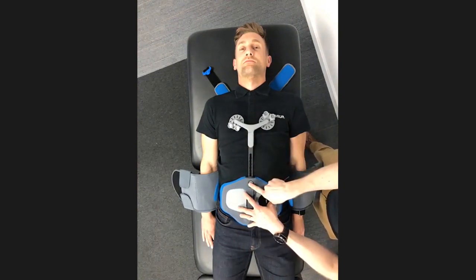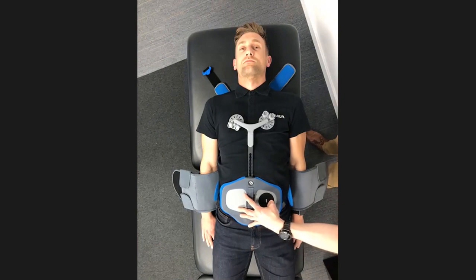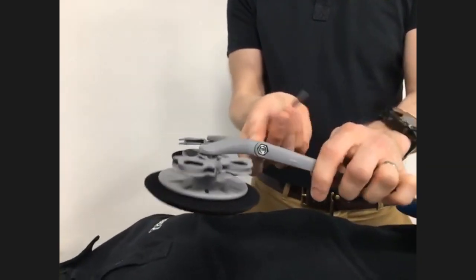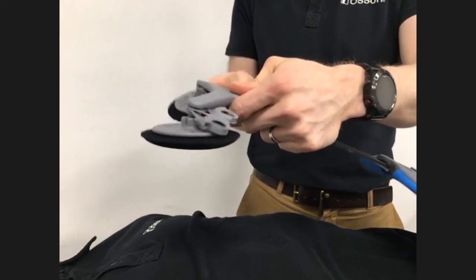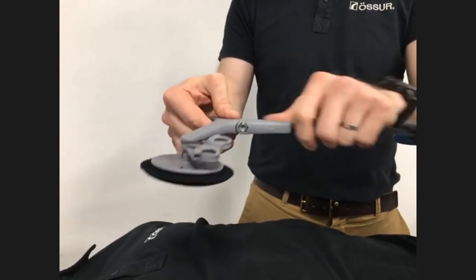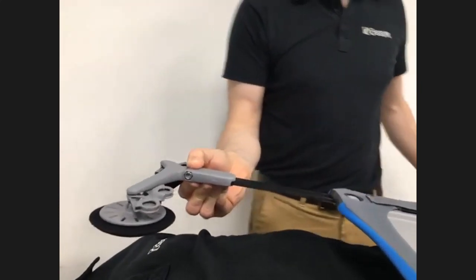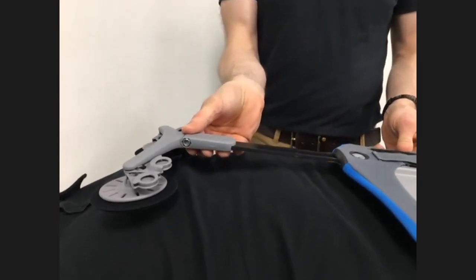Okay, so we've got a height adjustment mechanism here. This strut can also be contoured, so you can actually bend this to contour it to fit the shape of the patient. And if we look at this from the lateral side using the dynamic camera, what we can actually do is make adjustments to this here. So there's an included Allen key. So we just undo this, put that to one side, and you can see that we can actually contour this to fit the shape of the patient and make sure that we've got a nice low profile fit. There is also the option of adding an extra link. So we can actually take this out in order to bring this up and fit a very long patient. So you can actually adjust it.